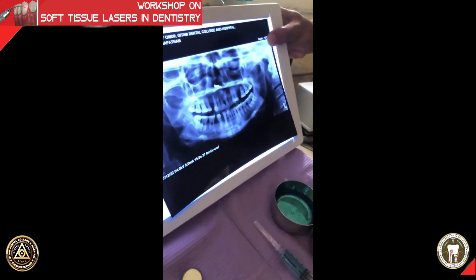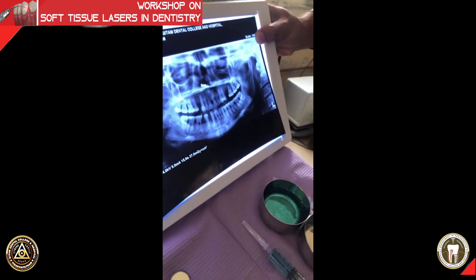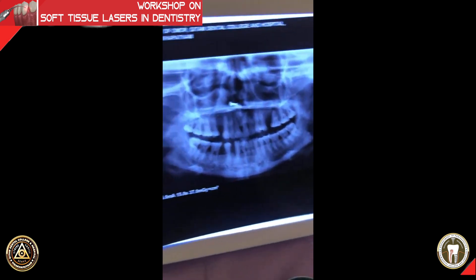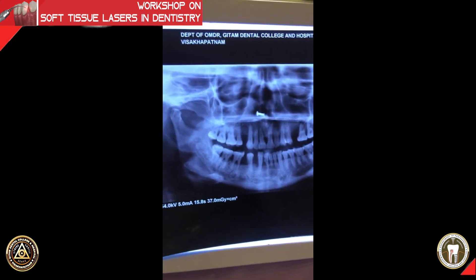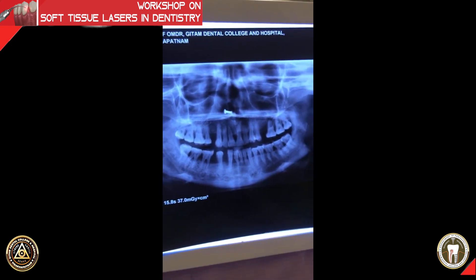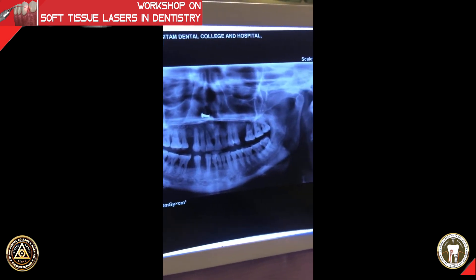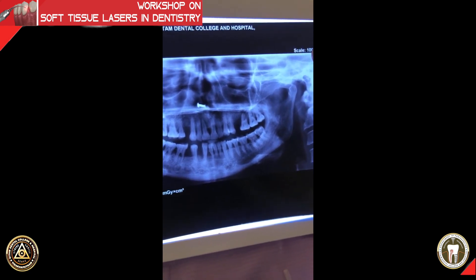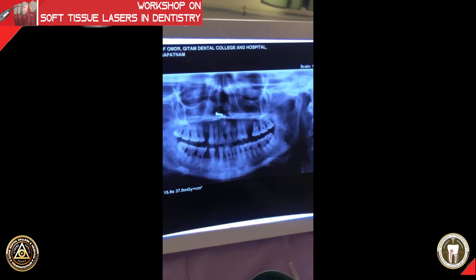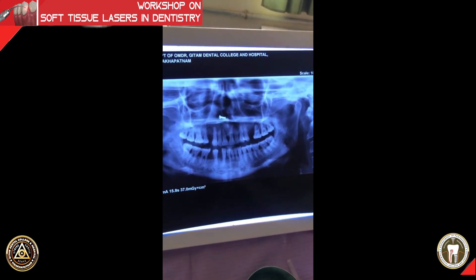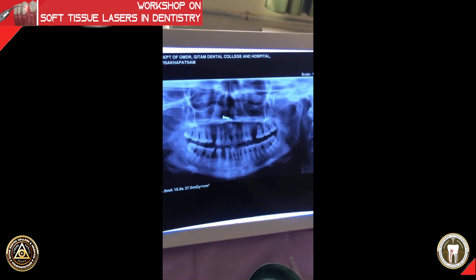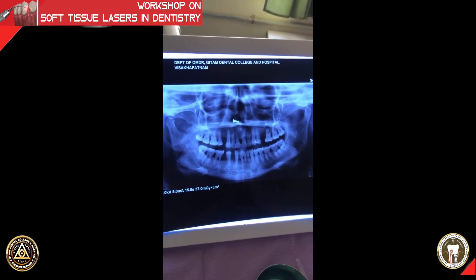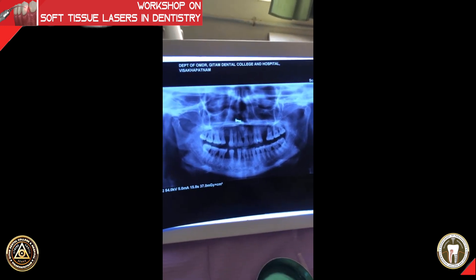Good afternoon. We're going to be showing you one live case of photodynamic therapy. You have got some basic idea that you need a photosensitizer dye and you need a laser with an appropriate wavelength — or a light source with an appropriate wavelength. We will explain how it actually works: the type 1 reaction, type 2 reaction, and what is going to happen.